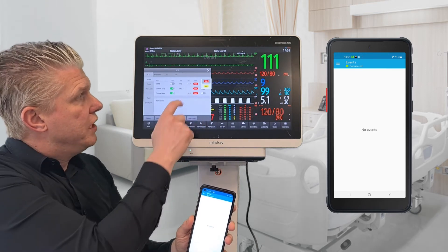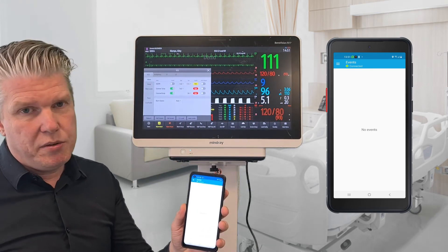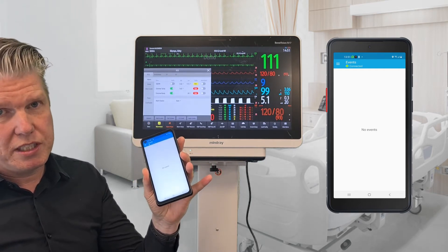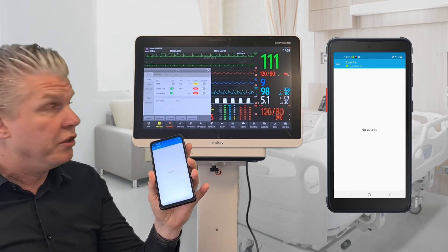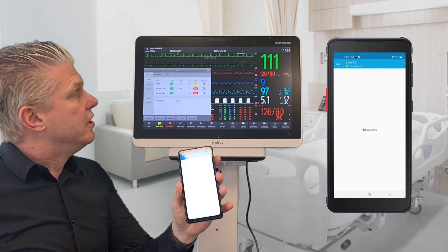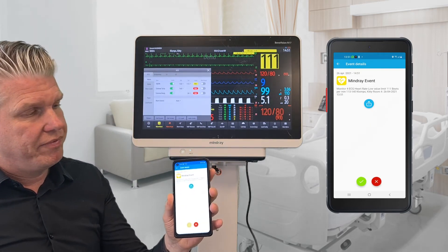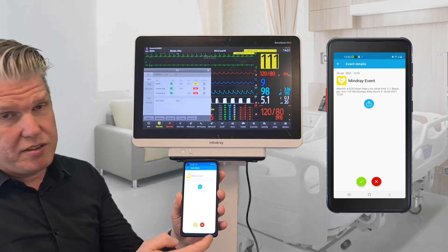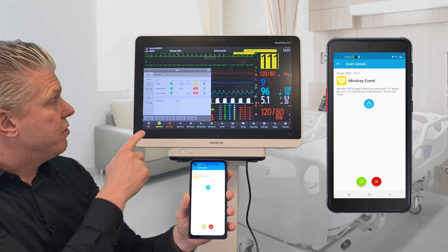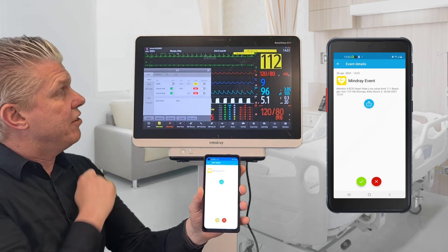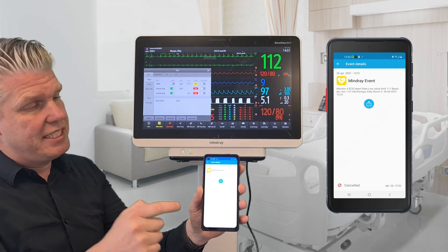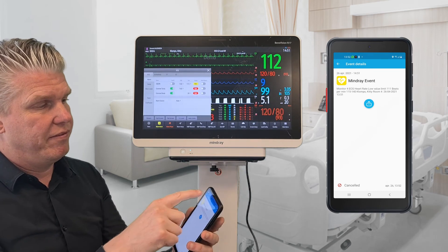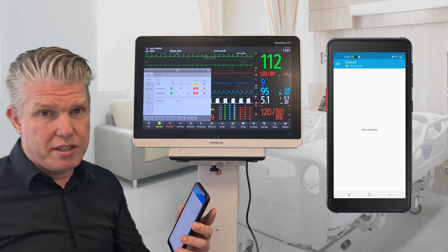When I create another alarm, in this case yellow, you will also hear the same sound which belongs to the yellow alert. If I enable the sound, you will see the yellow alert and now I can press accept or decline it. I can also decline it on the machine and in this case it will automatically be declined on my smart app. So both are possible.